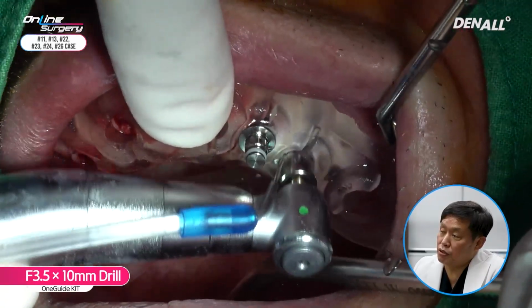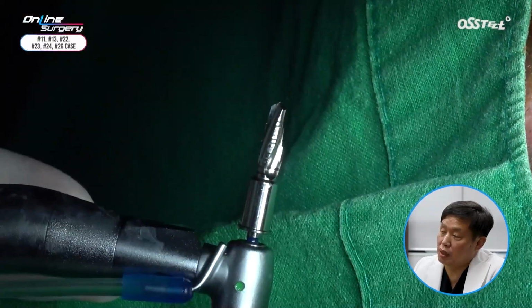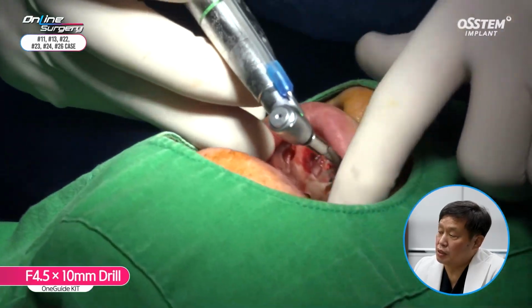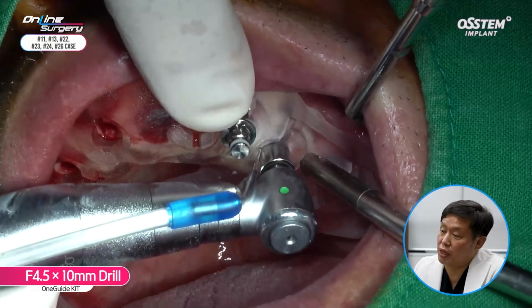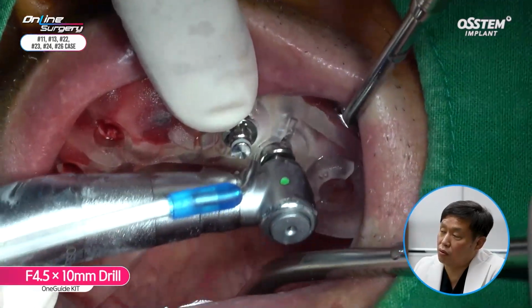Through a pumping action, I made sure there was no bone heating. Next is the 4.5 by 10 mm drill. In number 24, a 4.5 diameter implant was planned. The 4.5 by 10 mm OneGuide drill was used.